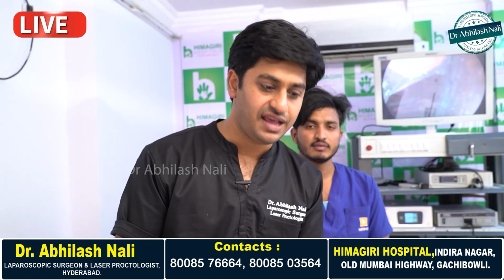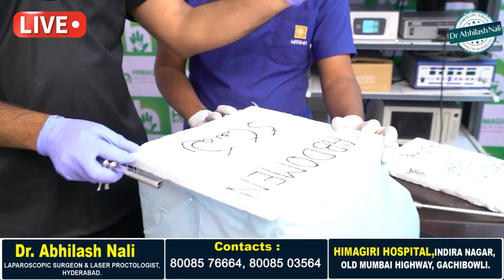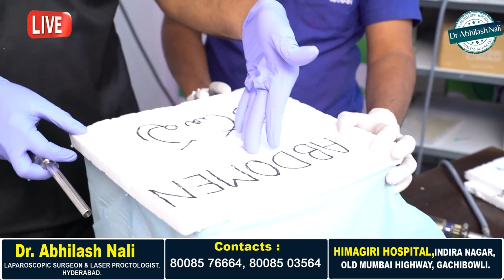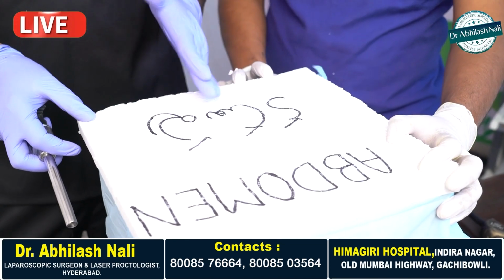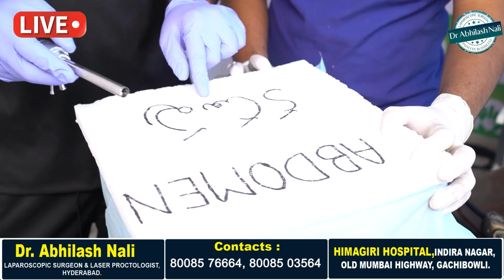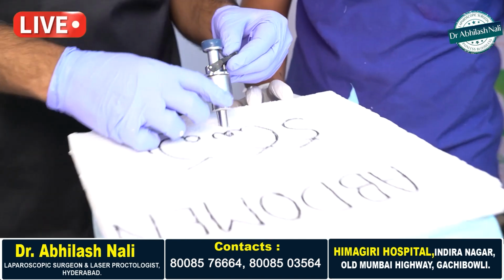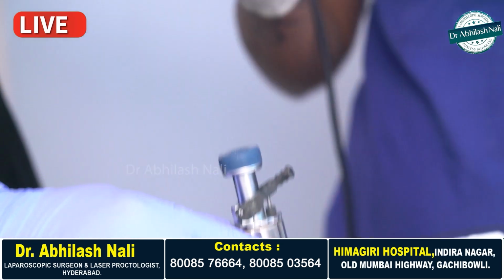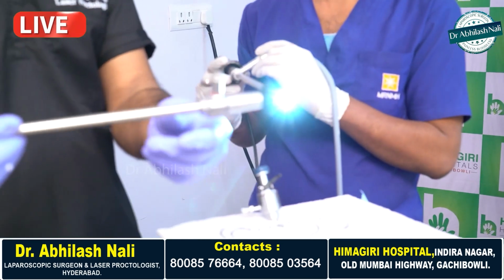But how exactly will a laparoscopic surgery be performed? Consider just this is the abdomen. In open surgery, we made a long incision to have access into the abdominal cavity. Whereas in laparoscopic surgery, instead of cutting open, through a 1 centimeter incision we'll be placing something called a trocar into the abdomen, and through this trocar we will be introducing the laparoscopic camera, and this is how a camera actually appears.